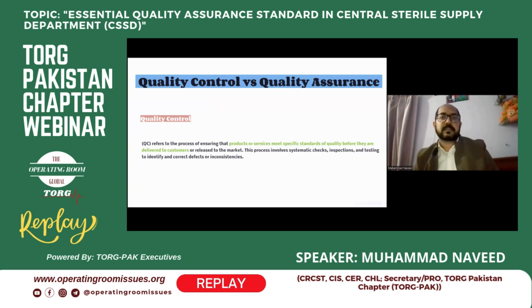In our CSSD, we deliver instruments, medical devices and other equipment to the OR or other clinics. So before delivery, we make sure the quality is up to standard or not. This is called quality control when we are talking about CSSD.